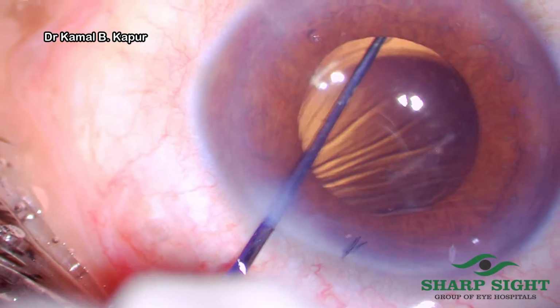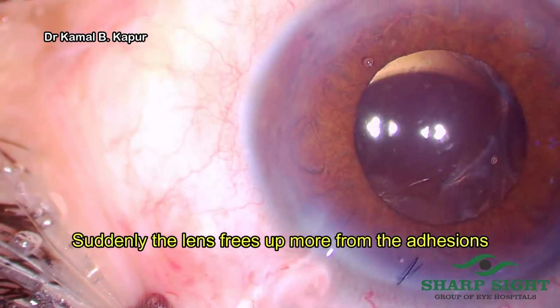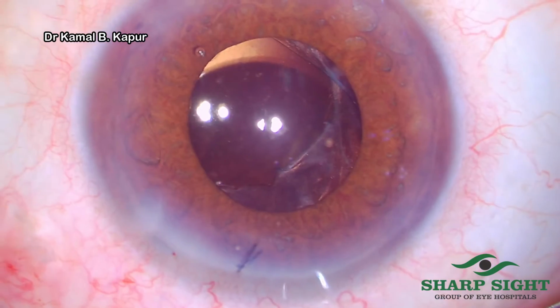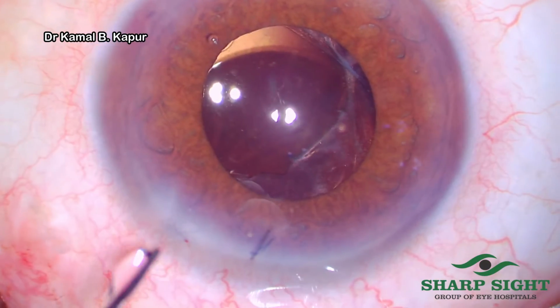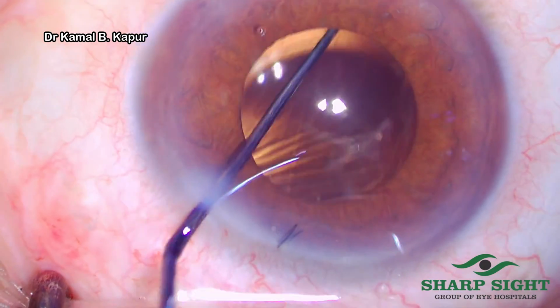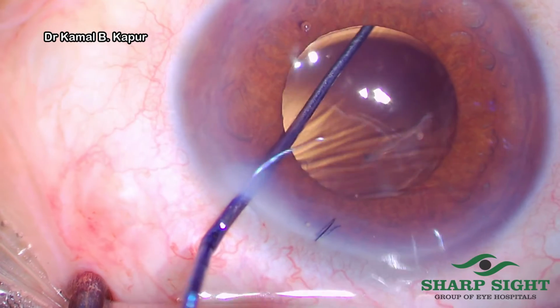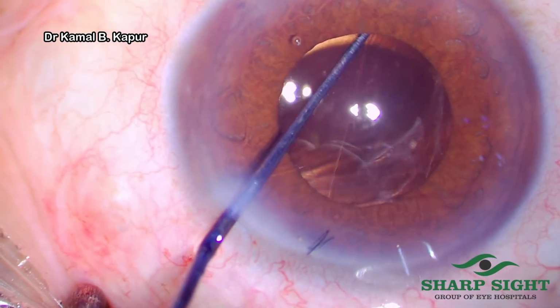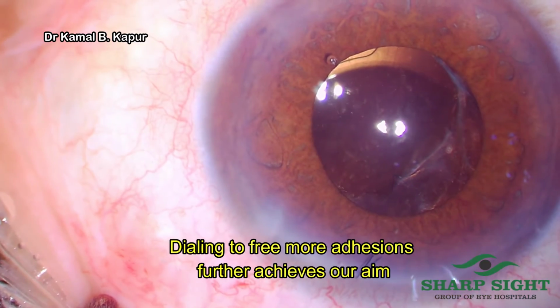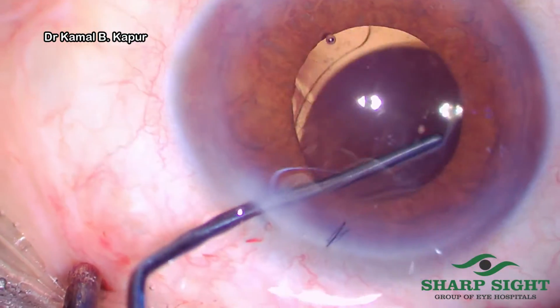Some slight amount of dialing was possible and the IOL is again now starting to center up. We again attempt the same maneuver and free up the haptic which could have been caught between the anterior and posterior capsule, and we dial the lens back in place. Now mind you, this dialing would not have been possible if we had not freed up the anterior and posterior capsule adhesion on the right side of your screen.